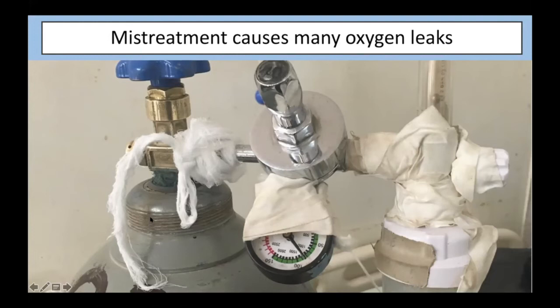And I can tell you that in many cases, reports tell us that in certain hospitals, up to 50% of the oxygen that could be provided to patients is lost due simply to leakage. We want to avoid leakage by avoiding damage, and we want to avoid damage by using gentle care to install the regulators and flow meters properly.